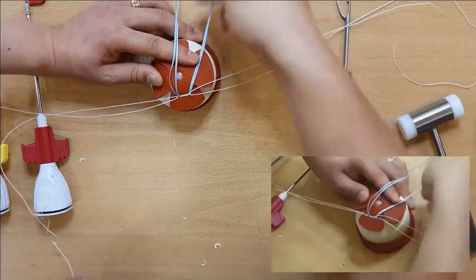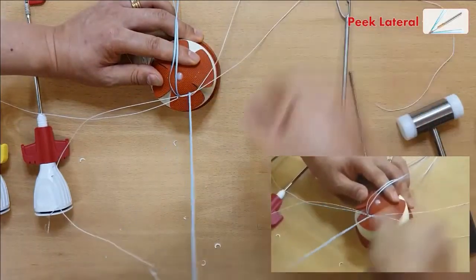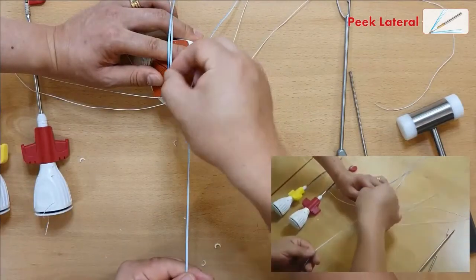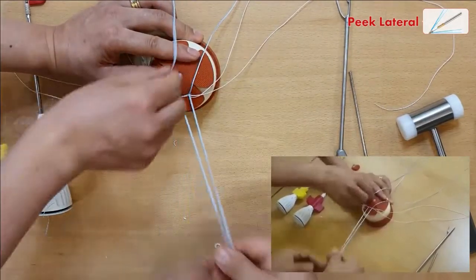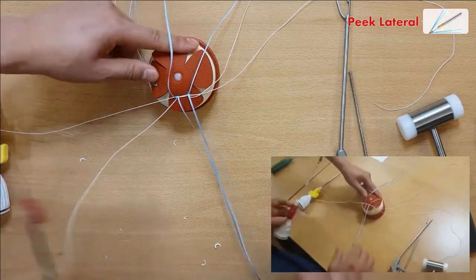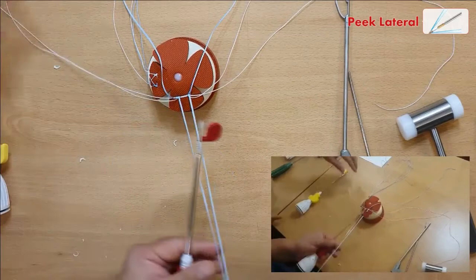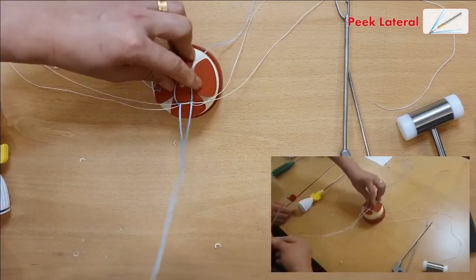I'm going to pass the fiber wires — one for medial. And we're going to use the Peak type, this Peak solid type. This is self-tapping as well.